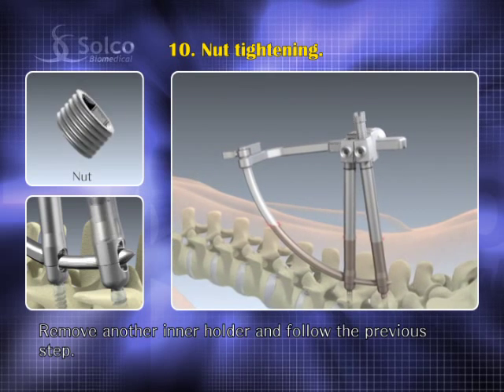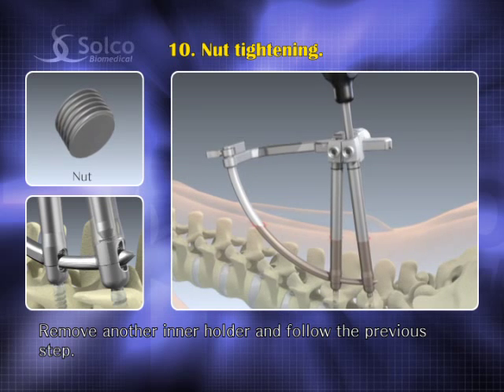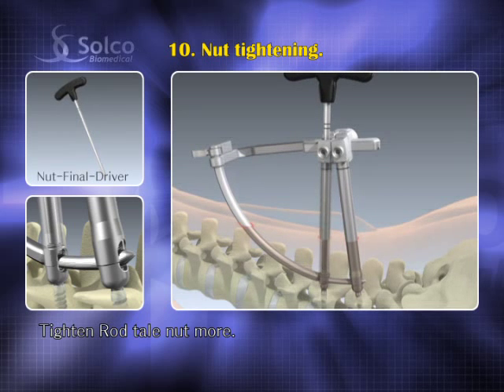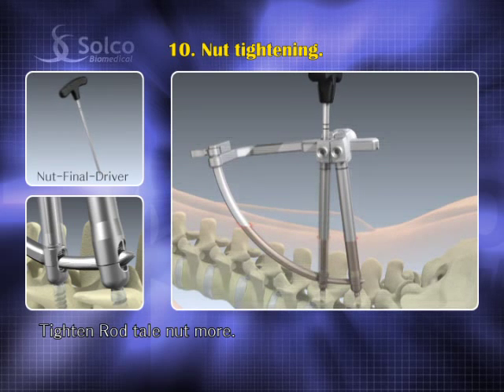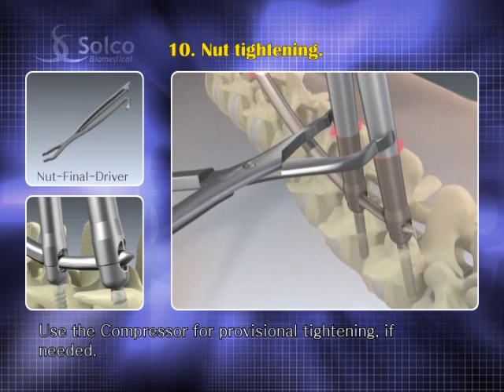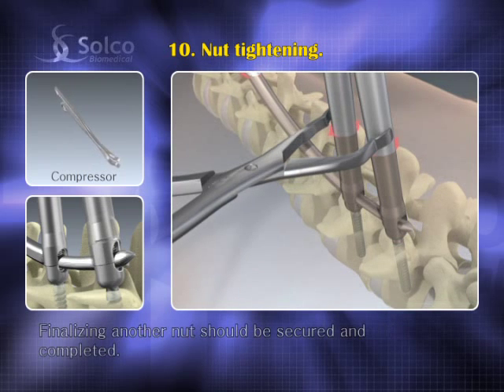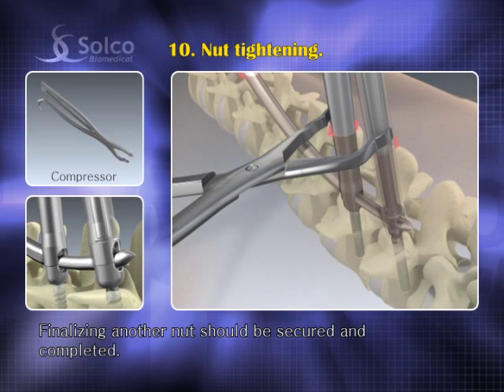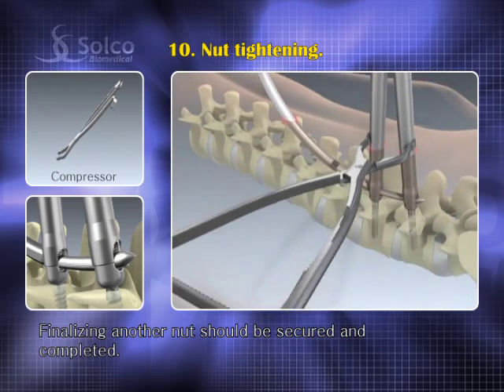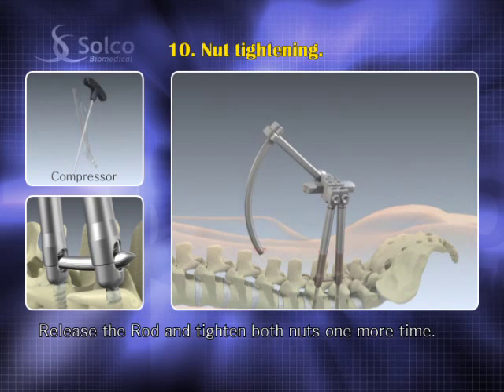Remove the other inner holder and follow the previous step. Tighten the rod tail nut further. Use the compressor for provisional tightening if needed. Finalize the tightening so the other nut achieves a secure and completed finish. Release the rod carefully and tighten both nuts one more time.